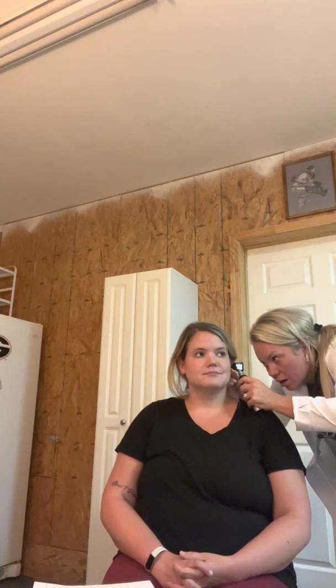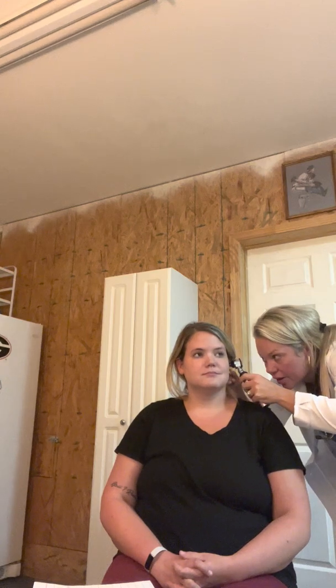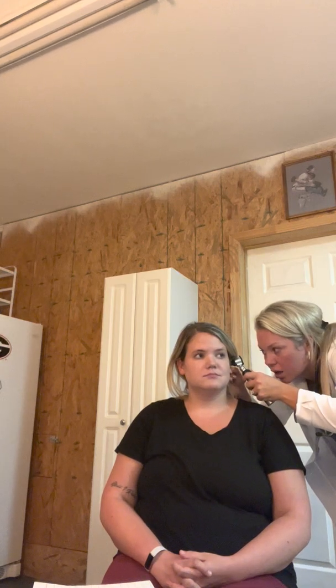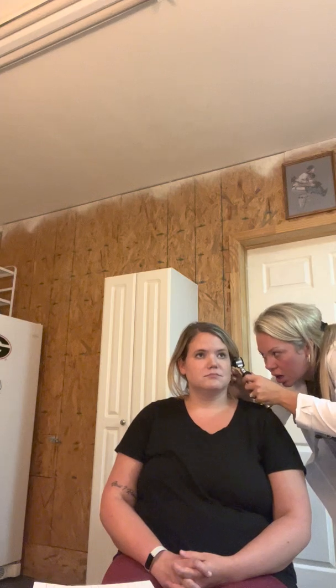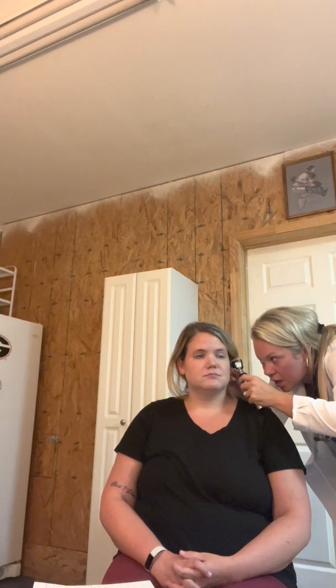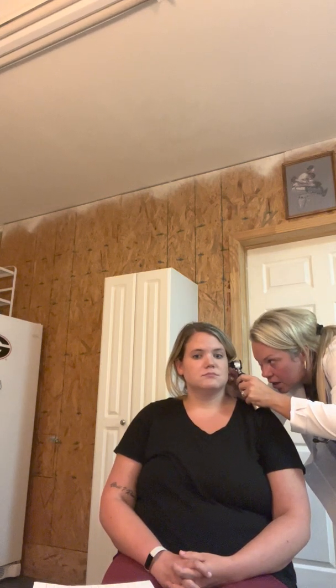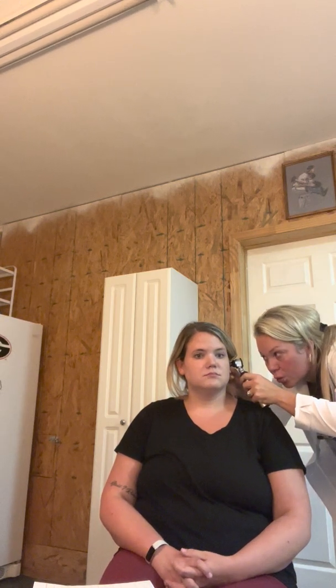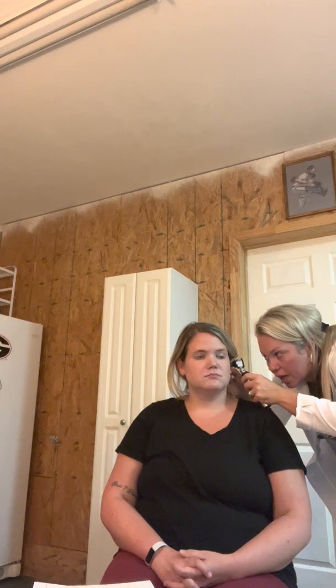Okay, Melissa. All right, so I note the ear canal. There's a small amount of earwax, some fine hairs on the outside third of the ear canal. I see the tympanic membrane. It is, again, translucent and gray. It doesn't appear to have any fluid. It's not bulging.